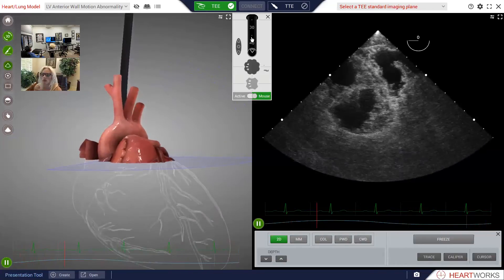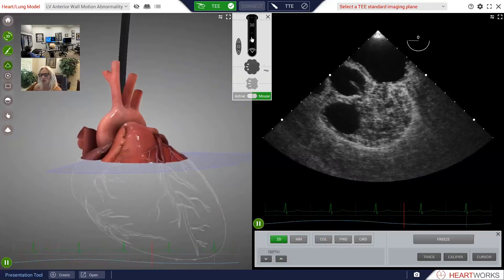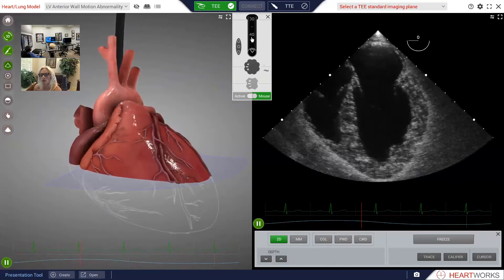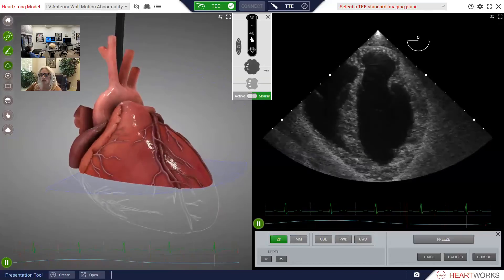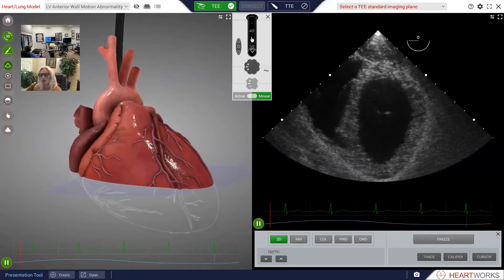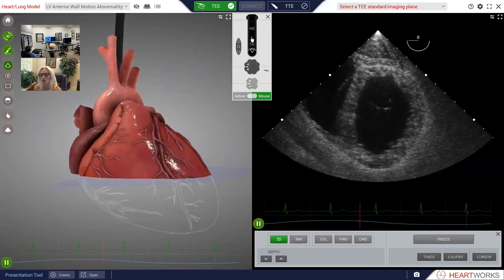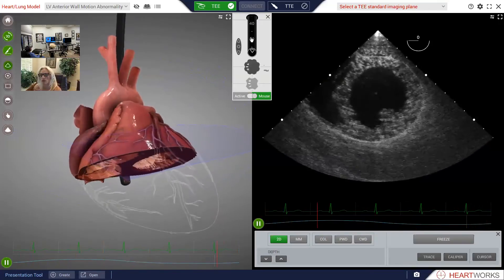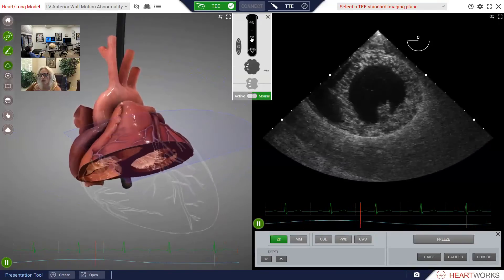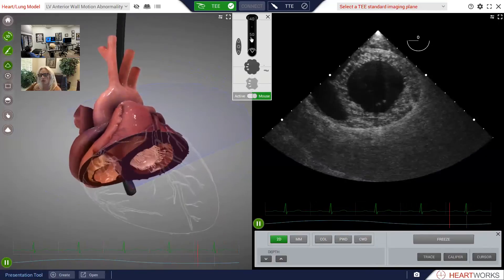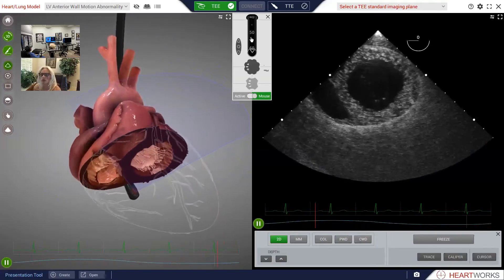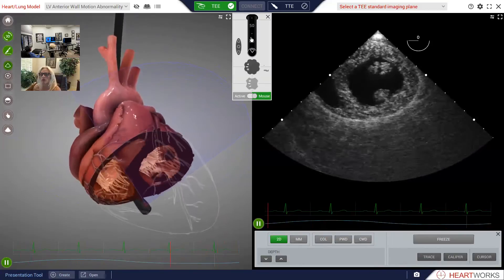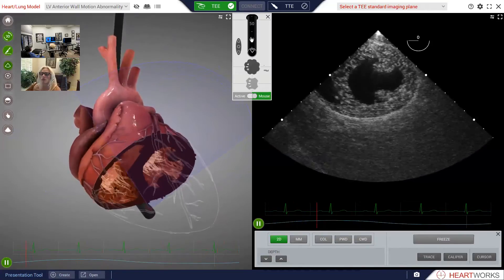Now here's the ascending aorta in short axis. And here comes the five-chamber view. And here we are in the four-chamber view. As we push in more slowly, we'll see the coronary sinus and long axis emptying into the right atria. And as we push in a bit further, we'll go through the base of the left ventricle with the mitral valve. As we go in a bit further, we'll come up on the papillary muscles — let's just stop there.